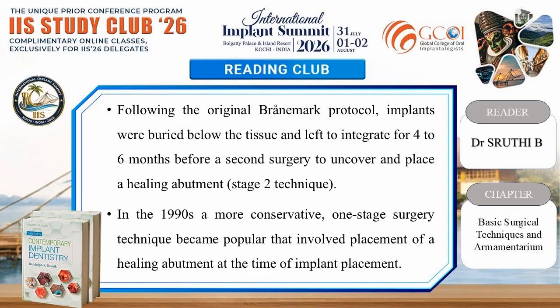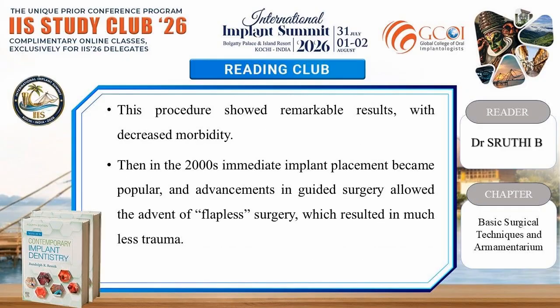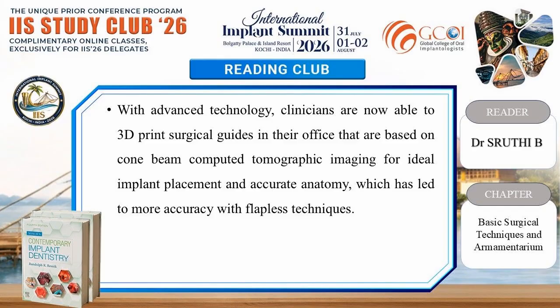In the 1990s, a more conservative one-stage surgery technique became popular that involved placement of a healing abutment at the time of implant placement. This procedure showed remarkable results with decreased morbidity. Then, in the 2000s, immediate implant placement became popular, and advancements in guided surgery allowed the advent of flapless surgery, which resulted in much less trauma.